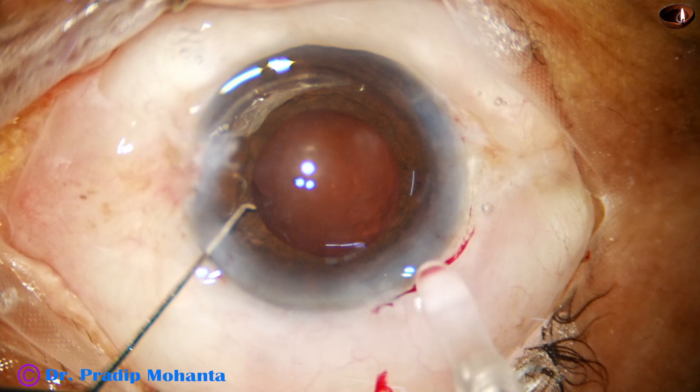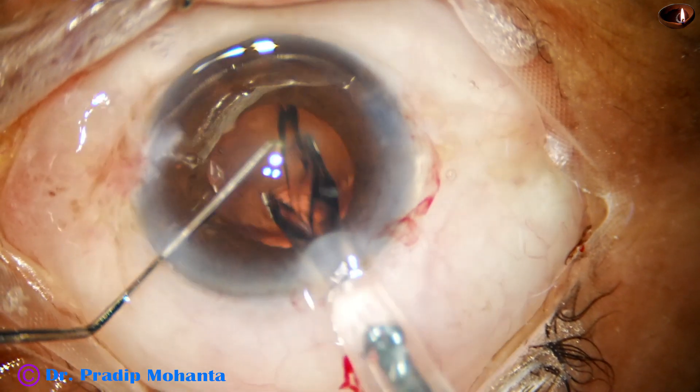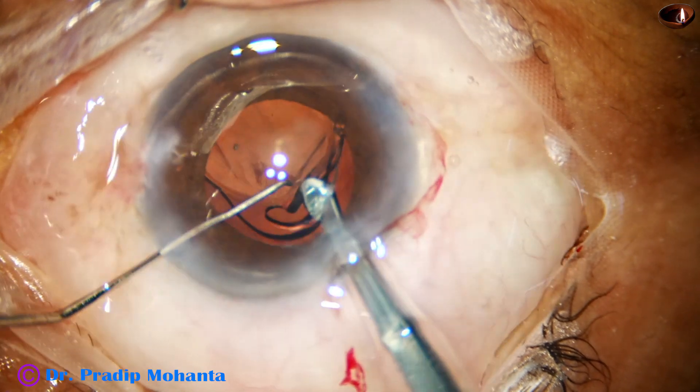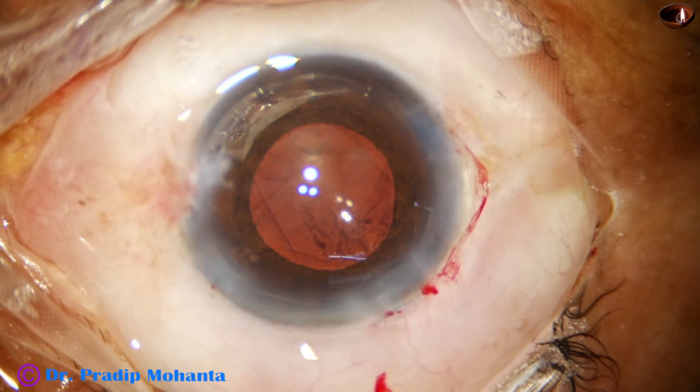There is very little or no cortex remaining. Now I inject the lens — this is a hydrophilic acrylic, single-piece, monofocal intraocular lens.